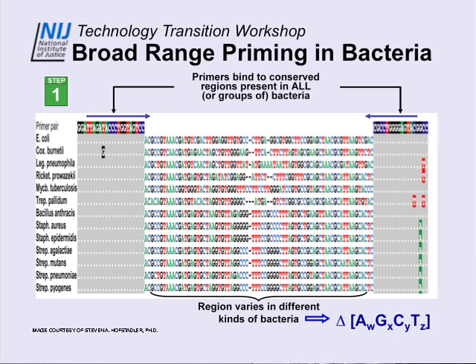And over here we have similarly a very highly conserved region, with a couple of variations here which are tolerated by PCR. So this primer pair, this primer plus this primer, will amplify any of these organisms and many, many other hundreds that are not shown on this list.